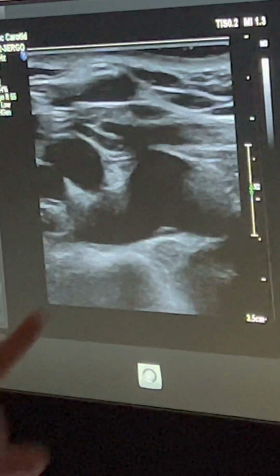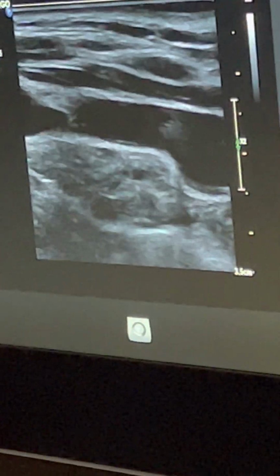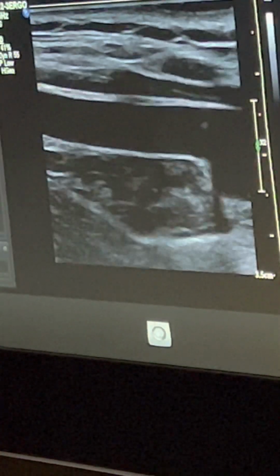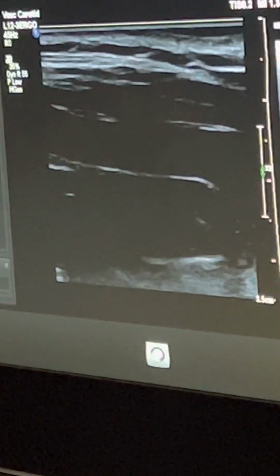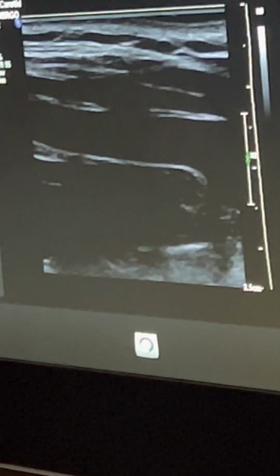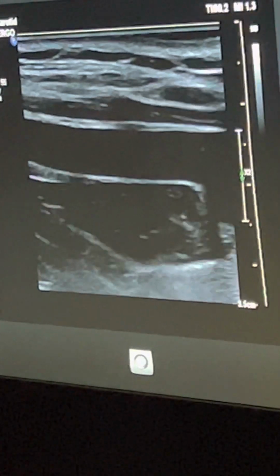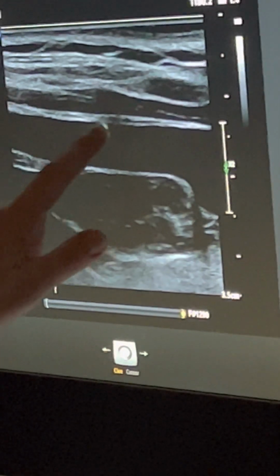For her, lucky for me, I can see as proximal as you can get. And then we're going to turn longitudinal on it and get our long images, okay? And once again, what I want to do is clear out those echoes, but here's the difference. Clearing out the echoes and then losing my wall, that's too much. I still want to see what's around it, okay? Use a lot of TGC probably on carotids. A lot of TGC on vascular in general, yes. So now I'm going to adjust it to where I don't have echoes and I can see the wall.